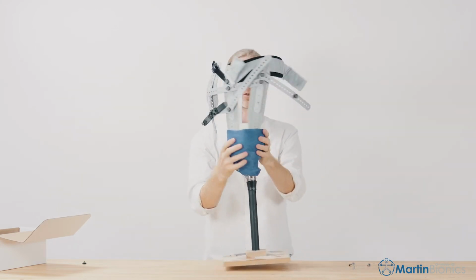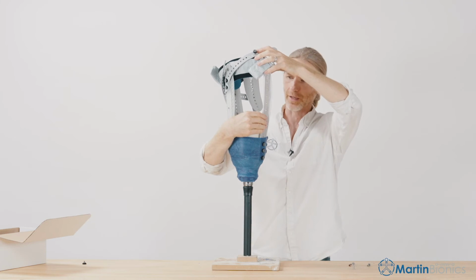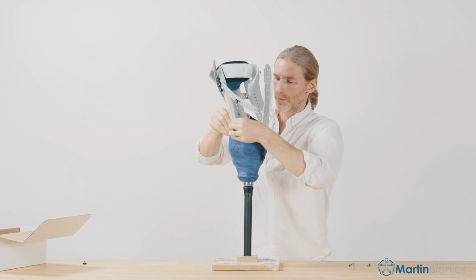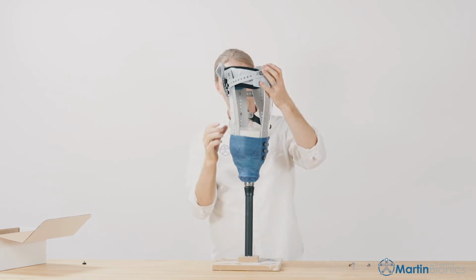Now, if I spin this around on the posterior side, and all this isn't connected yet, but on the posterior side, the posterior lateral strut with the posterior medial strut should frame the hamstring muscle belly. It should sit due posterior. So I'm going to bring this in around a little bit more, so it would be more underneath the tuberosity level. So that kind of frames that hamstring muscle belly a little bit better.